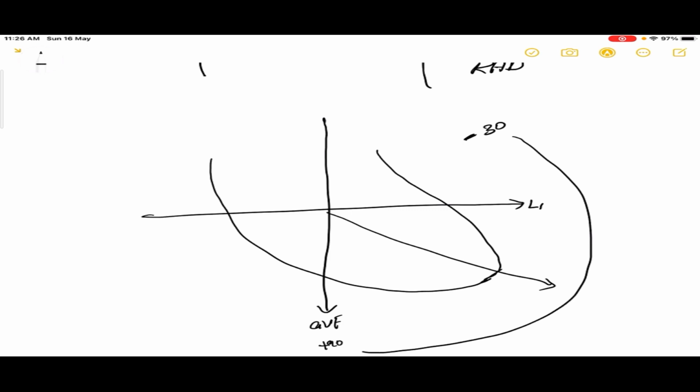Now let's see what happens in hypertrophies. In left ventricular hypertrophy, the left ventricular muscle is enlarged, causing increased electrical activity in the left ventricle. So the vector is pulled towards the left ventricle, that is the left side, producing left axis deviation.